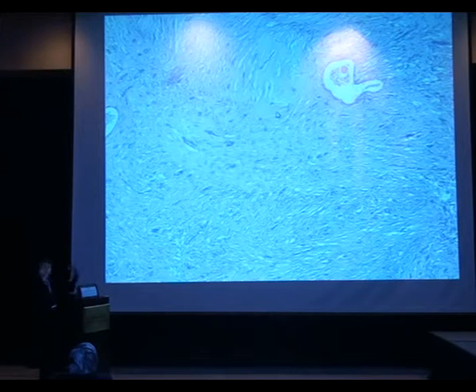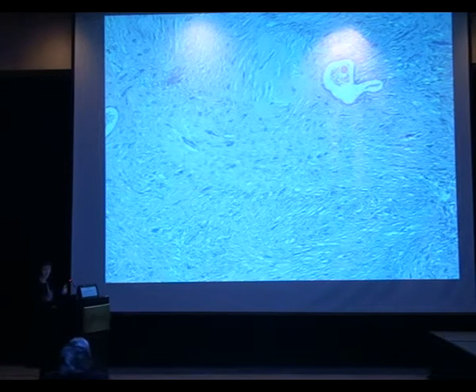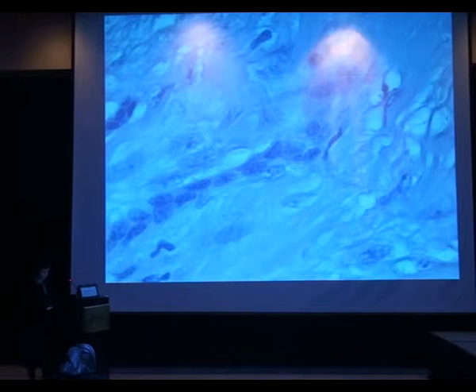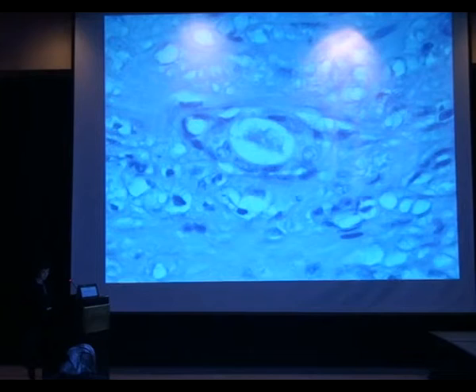So if we look at low magnification, first aspect is the fibromatosis, and then when we go to higher magnification, we see that we have tumor cells, that we have some aspects of cords of tumors, that we have some aspect of metaplasia, and that we have some aspects of, but very few of glands. Like here, where you have those type of aspects, and you have also isolated or fusocellular tumor cells. You go to a higher magnification, you see that they look like malignant cells.